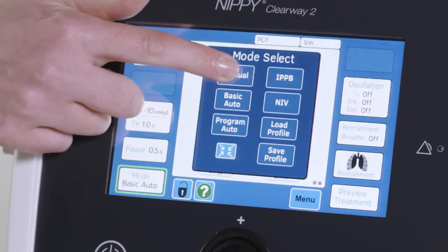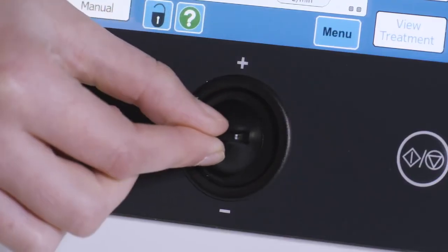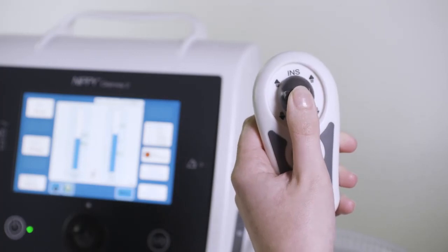If you are using the manual mode, use the switch on the front panel of the Clearway 2 or the handheld control, as instructed by your clinician, to deliver treatment.